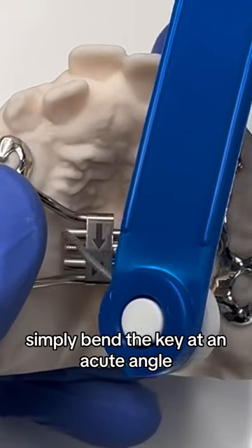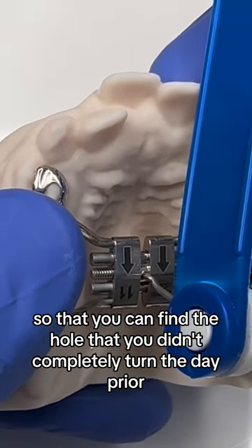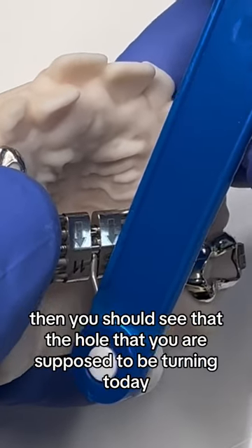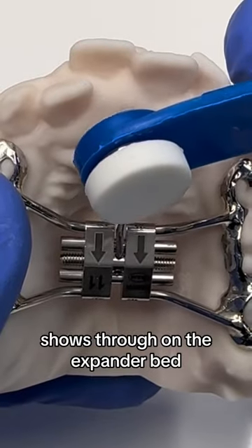To fix this issue, simply bend the key at an acute angle so that you can find the hole that you didn't completely turn the day prior. Then go in there and push back until you can't turn anymore and complete the turn. You should then see that the hole you are supposed to be turning today shows through on the expander.